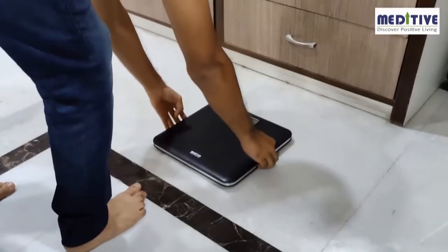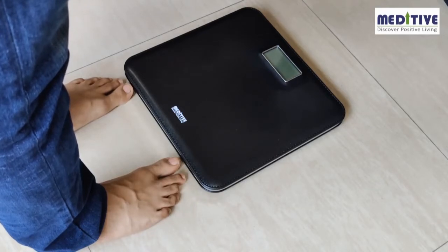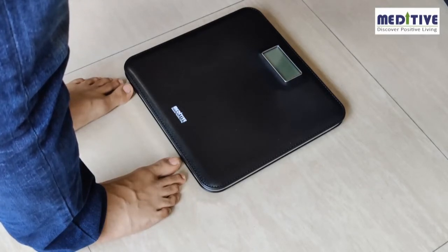It is recommended that you always take your weight preferably at the same time of day and without shoes. A difference of 100 to 200 grams can appear because of these factors.